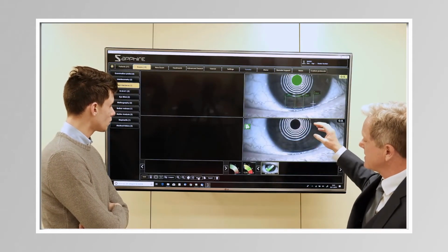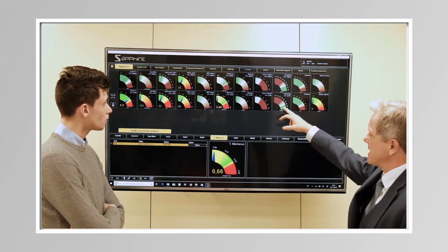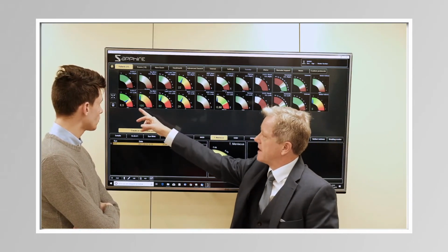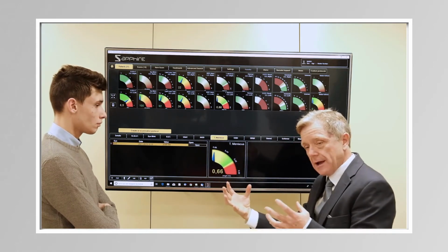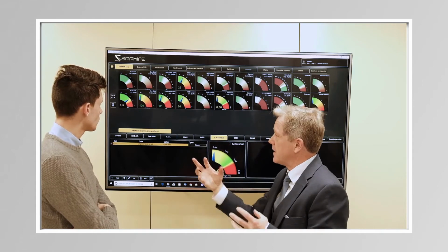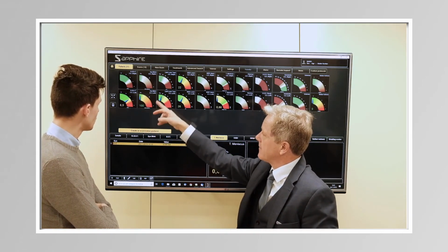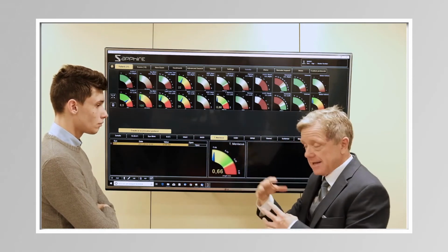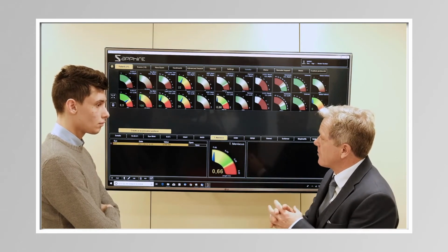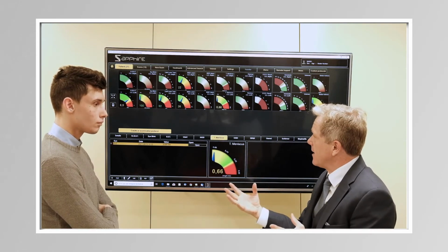Okay, we can go back to the examinations, and if we save all this, we can go and see the examinations we've conducted on the left eye. Here we can explain to Mario, this is looking at the breaking up of the tears. We can see that the tears are breaking up a little bit early because you're not in the green zone, we're approaching the red area here. Your eye blink is in the green zone, so you're blinking and the motion of the eyes is complete and great. The lipid layer, the oils at the front surface of the eye, again are great.